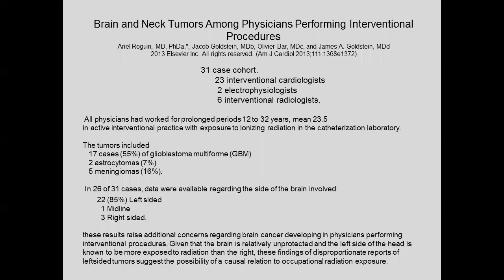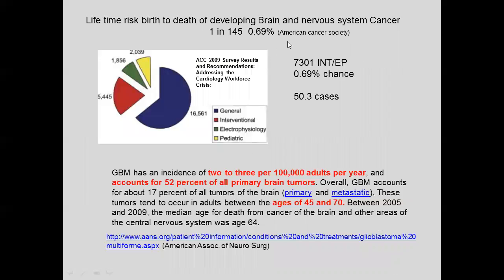But this was one that came out recently where they found 31 interventional cardiologists, electrophysiologists, and interventional radiologists who had brain tumors. They looked at 17 cases, 55% of them were glioblastomas. The interesting thing was 85% of them were left-sided. This number I'm not overly excited about because I did a little research.